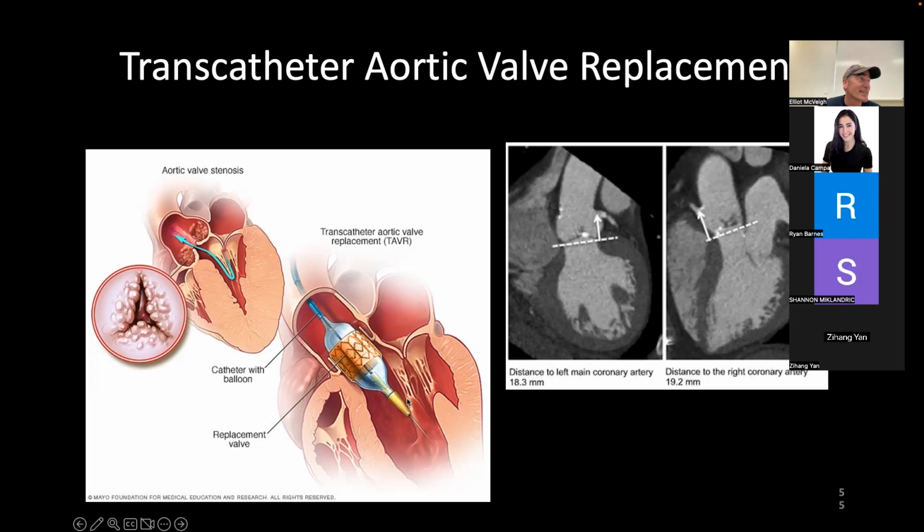Impressive that it stays in place, especially because that tissue is moving. So the comment was, it's impressive that this thing will just stay there and not dislodge and move up, or dislodge and move into the left ventricle, etc. And sometimes they do, and that's a risk, right?